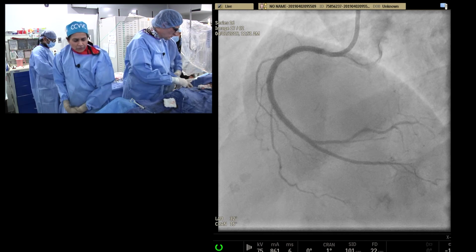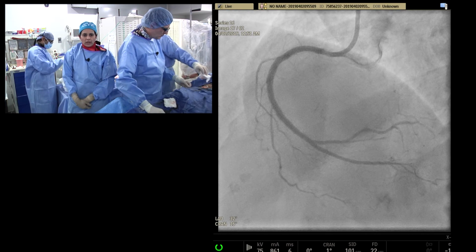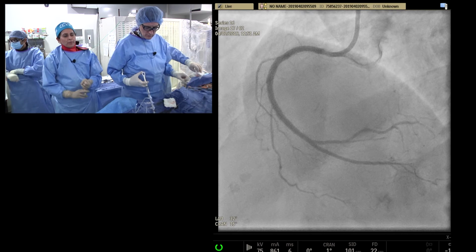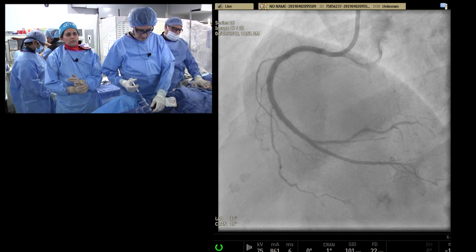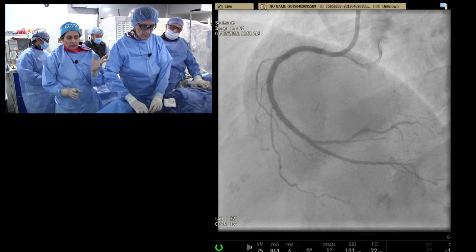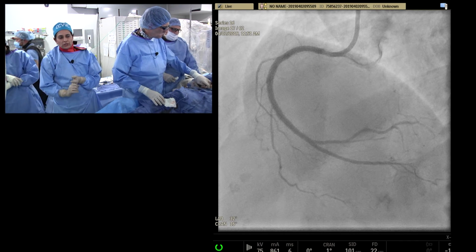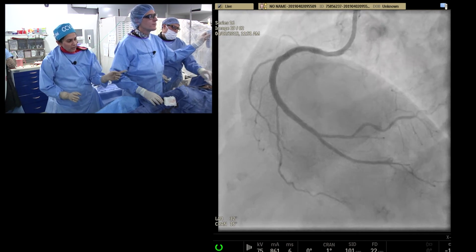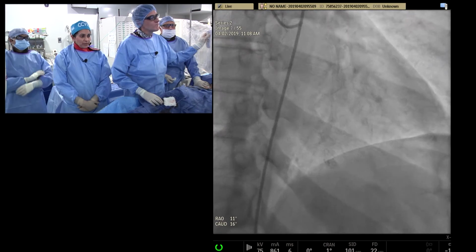So the couple of things we have made sure. We did IVUS, and we made sure the risk factors for stent thrombosis are very clear. She has passed 30 days after ACS, so they have risk of stent thrombosis. Long stent, which is more than 60 millimeters, she has right now. EF less than 30%, which she does not have. Other than that, any risk will be that kind of antiplatelet therapy that she'll be going home on.